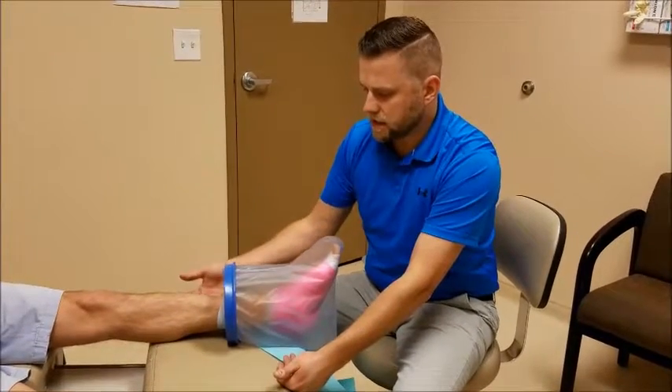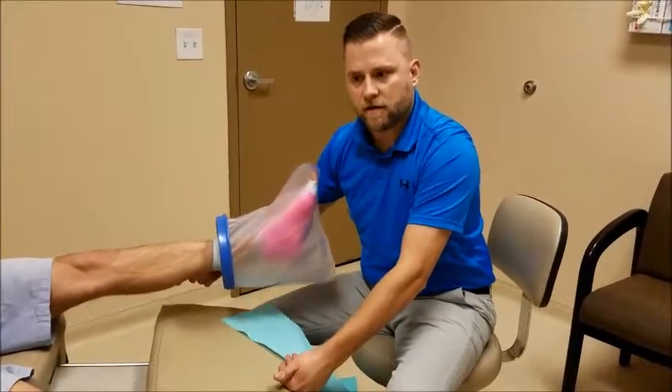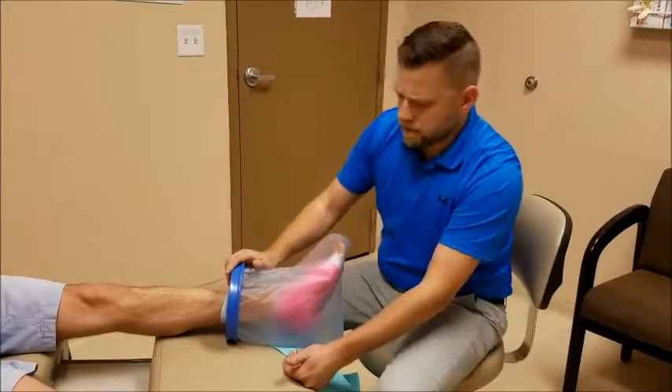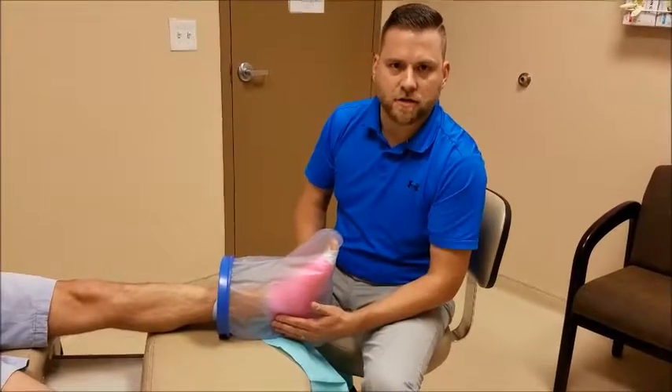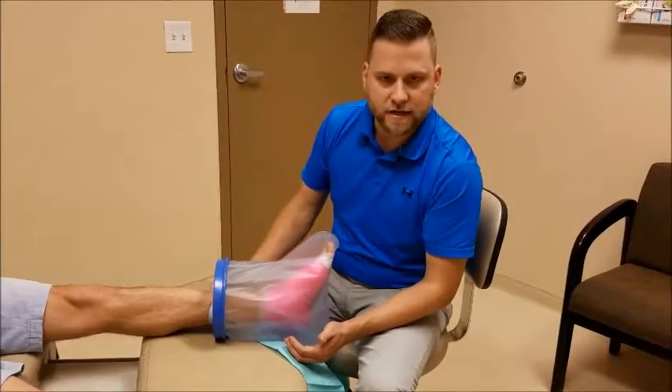Depending on what you've had done, sometimes you can put your foot down in the shower. Some people will take a bath and hang their leg out the side, and this would protect the dressing that way. If it were to leak and get on your dressing or cast, call the office right away so we can talk to you about whether we need to replace it.